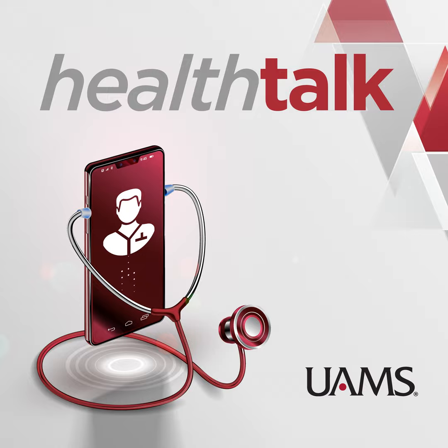And one of those things is that in the US in 2015, spinal cord stimulation using ultra high frequency at 10 kilohertz was FDA approved. And so the original research there was done looking at people with chronic back and leg pain, most often after having had several back surgeries. And what they found was that a majority of patients were able to see their pain reduced by 50% or more.